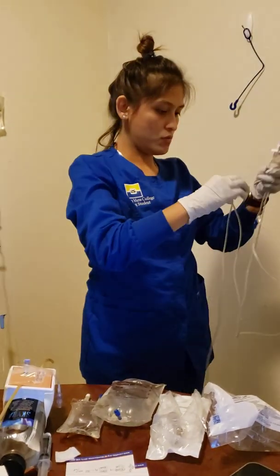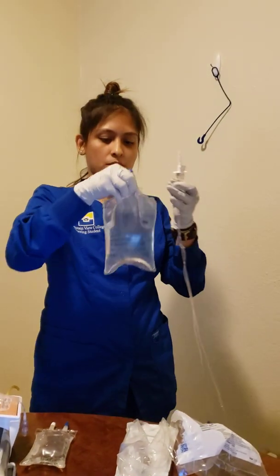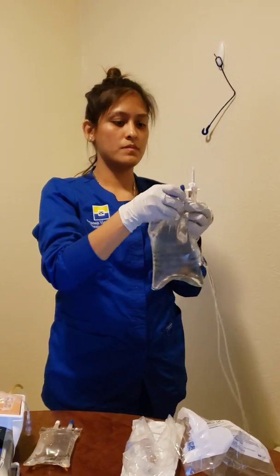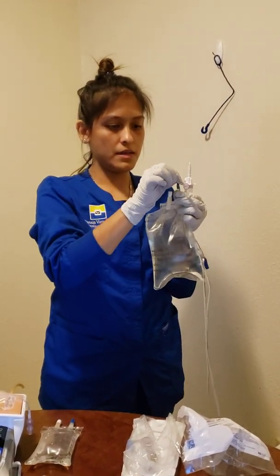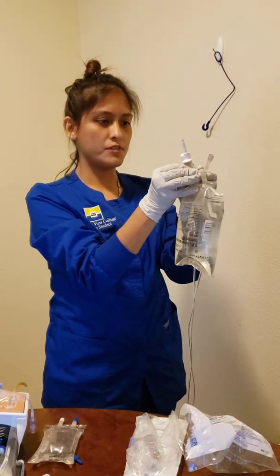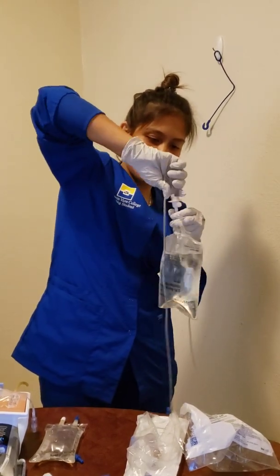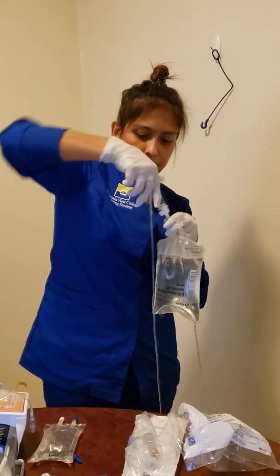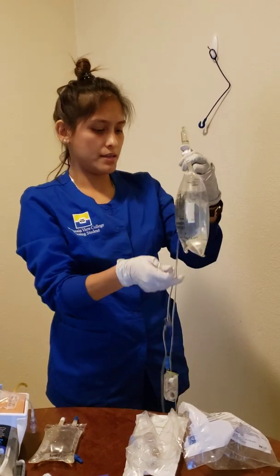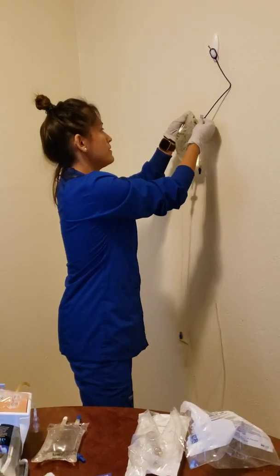It's untangled. Again, making sure that everything is sterile. I popped off the top to this thing here, and I'm going to clamp it in there. And I'm going to go ahead and hang it to prime.